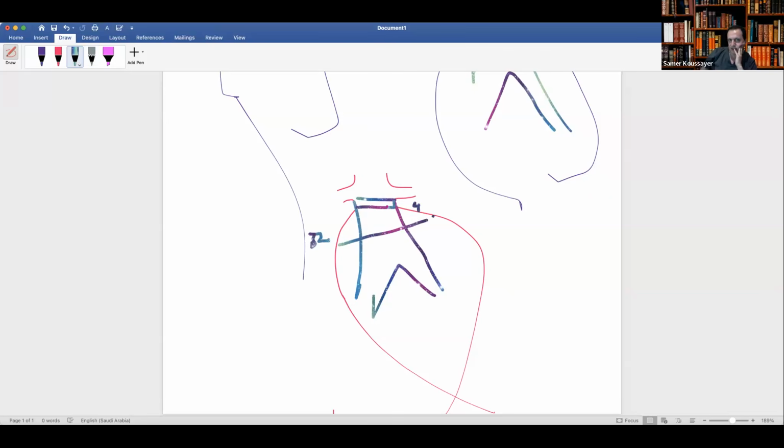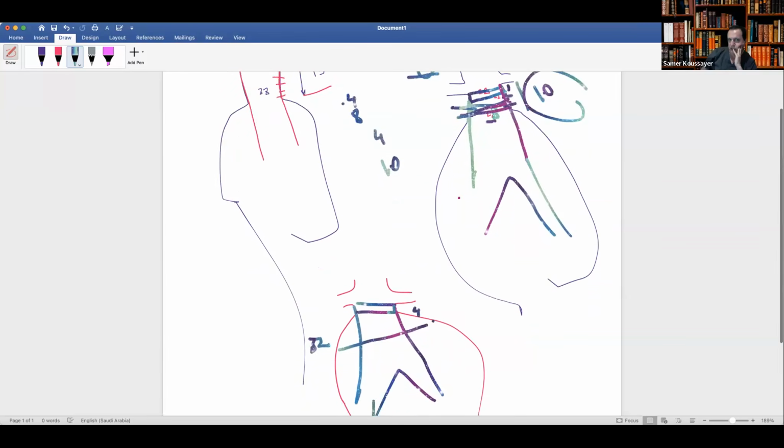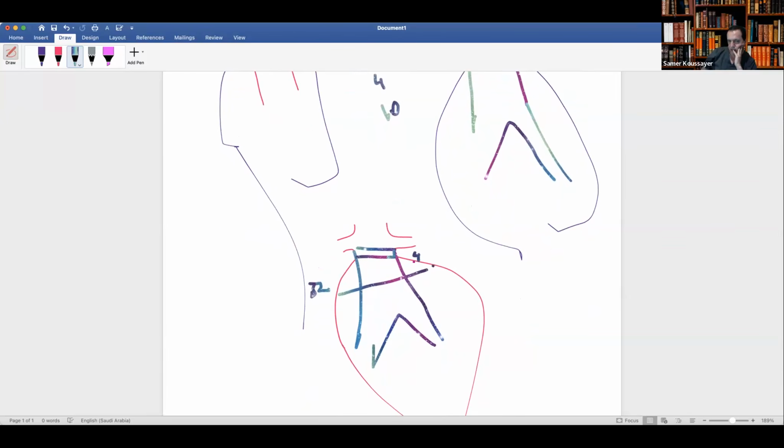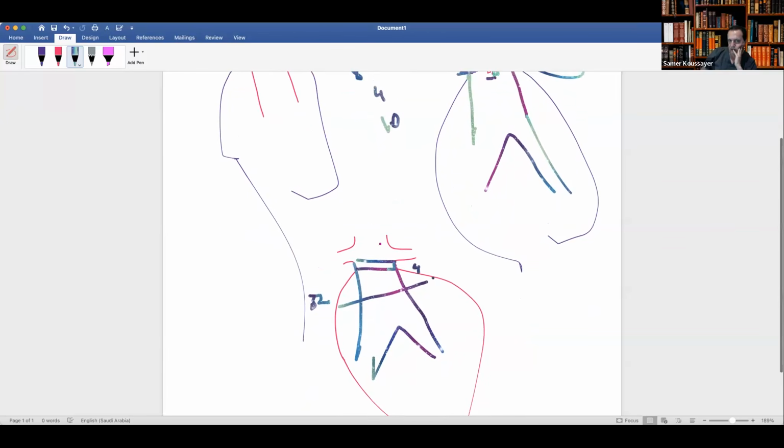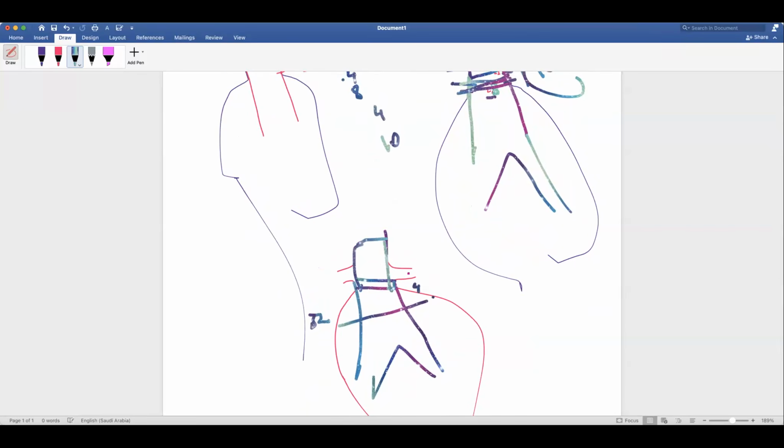You see, this is not enough because you only have a short neck, but you have no sealing zone. You see, the 10 millimeter sealing zone is not here. So this one has a short neck, long sealing. This is a short neck, no sealing. So this one you have to go higher because you need a neck. There's no neck here. Then you have to go up to here with your stent, with the EVAR. And then either use a chimney here or you do a FEVAR, sorry, FEVAR. Use a FEVAR here with the fenestration.